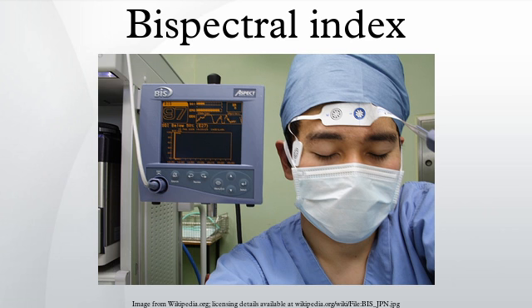History: the BIS was introduced by Aspect Medical Systems, incorporated in 1994 as a novel measure of the level of consciousness by algorithmic analysis of a patient's electroencephalogram during general anesthesia. This is used in conjunction with other physiologic monitoring such as electromyography to estimate the depth of anesthesia in order to minimize the possibility of intraoperative awareness.